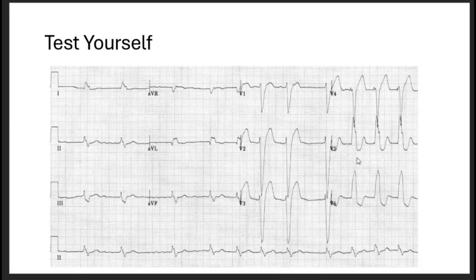I'm emphasizing this idea that when we say William, it doesn't have to look like a W for you to say, okay, if it's not a W, then it's not a left bundle branch block. No, that's not true. You just have to see deep S waves in V1, and slurred or notched R waves, for it to be left bundle branch block.